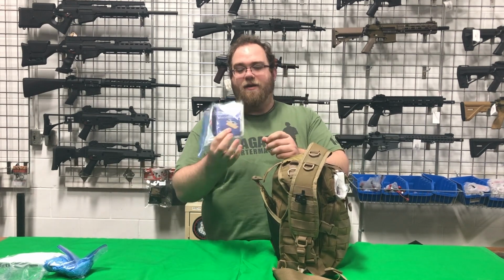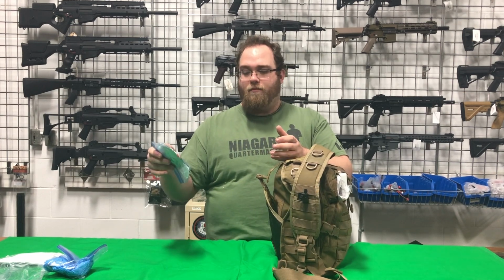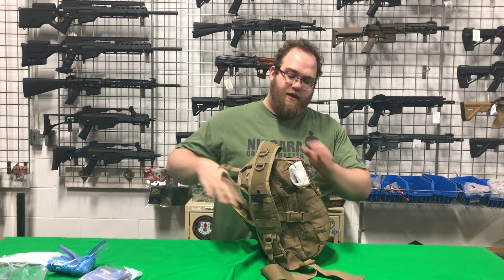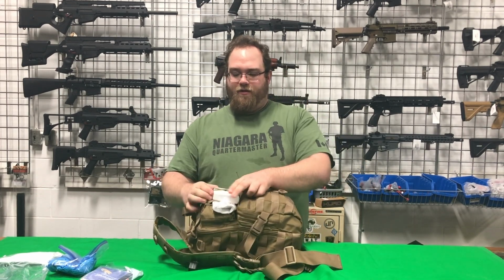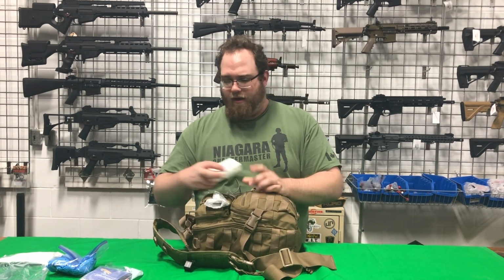Inside here is my basic first aid kit. And this is all my washable and waterproof plasters in one go. So if I need that, it's all there. Second part, micro first aid kit. This is basically your cuts, your scrapes, your bruises, anything that's little can go in here.